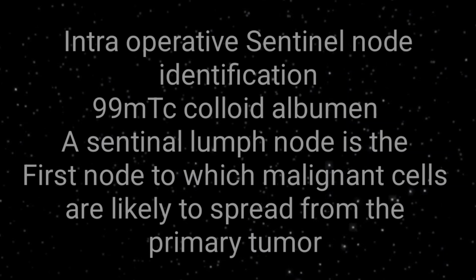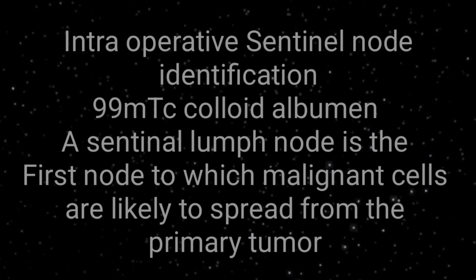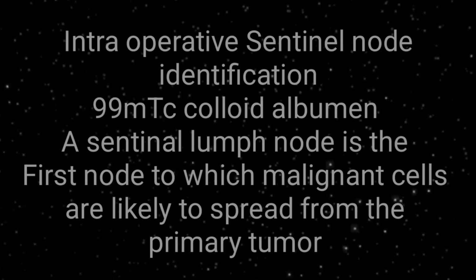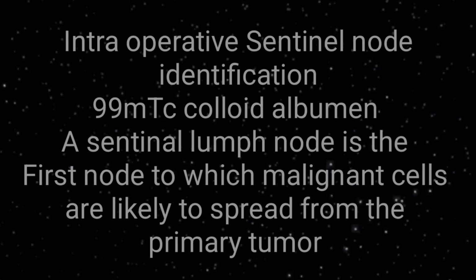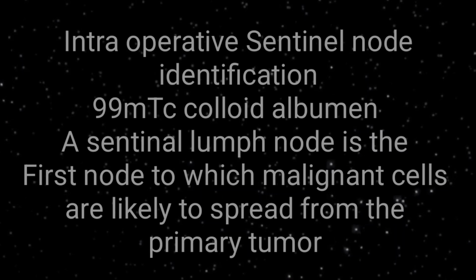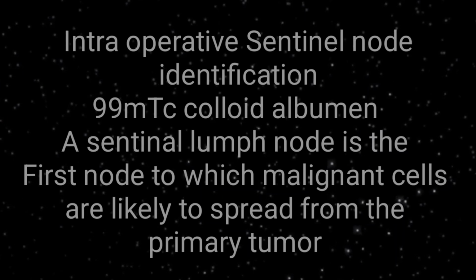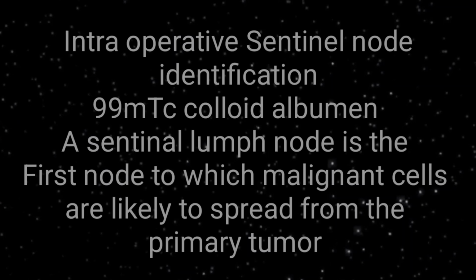It reduces the chances of leaving these malignant lymph nodes behind if you use this radionuclide imaging during the intraoperative procedure, so you can identify the invaded lymph node quite easily.